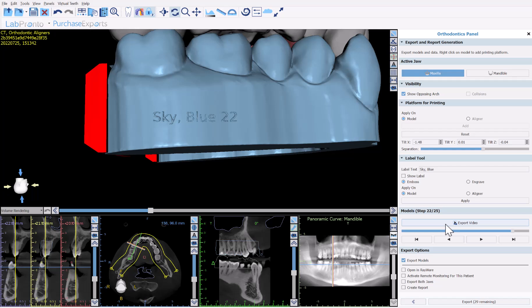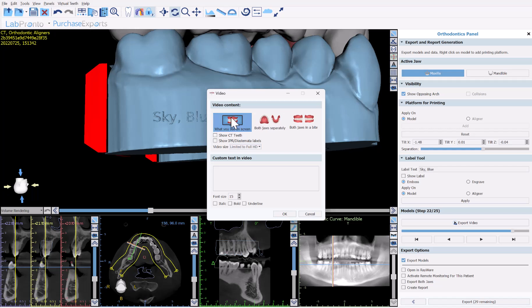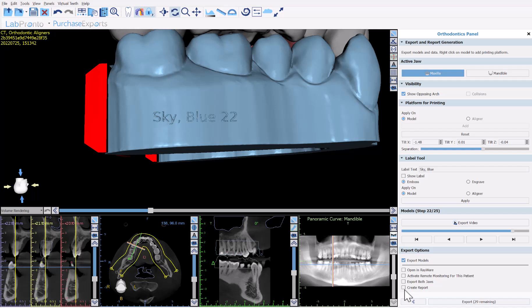We also have the export video option, available here as in the teeth movement stage. You can export a video of the teeth movements, showing what's visible on screen. Options include showing both jaws separately or in a bite view, CT teeth when relevant, IPR and diastema labels, video size and quality, and custom text with font and formatting options. For the actual export, export models should always be selected.